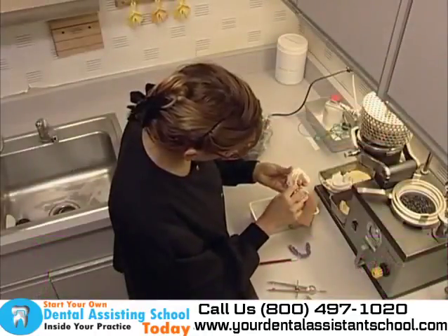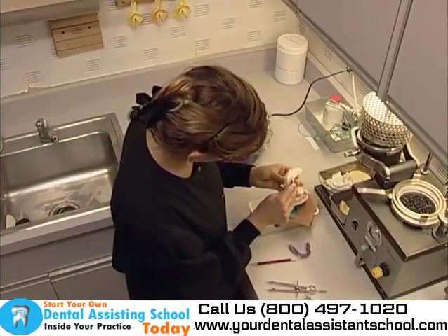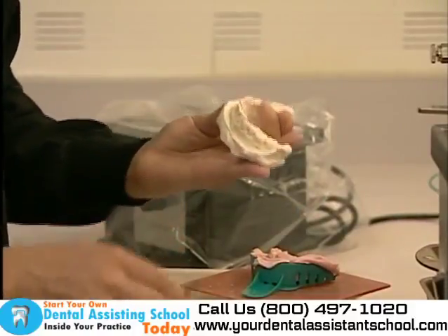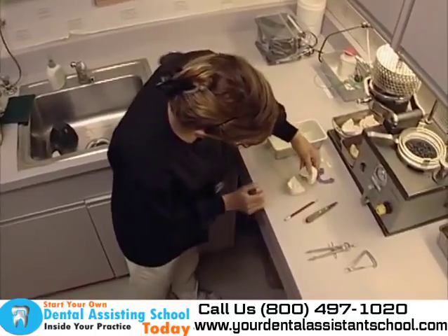To begin trimming, the dental assistant removes the excess material at the area behind the back molars, as it may interfere with the bite of the model. Often the dentist will give specific instructions as well as a preferred angle to be used. A supervisor should be consulted as to the preferred technique used in trimming a model.